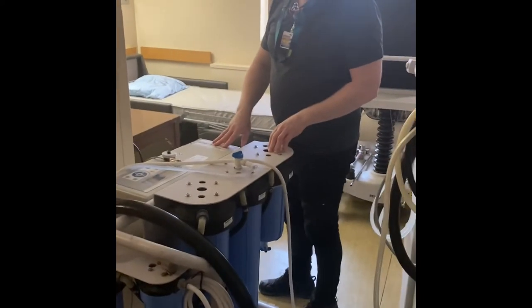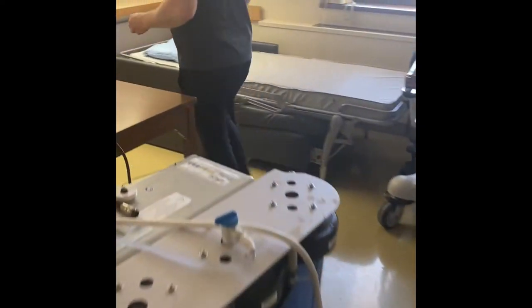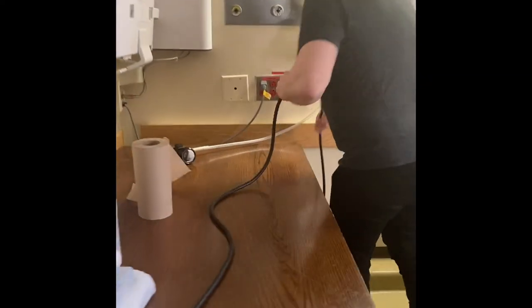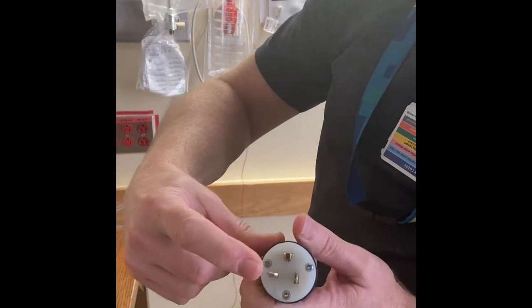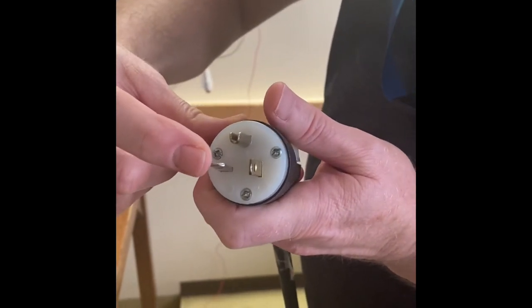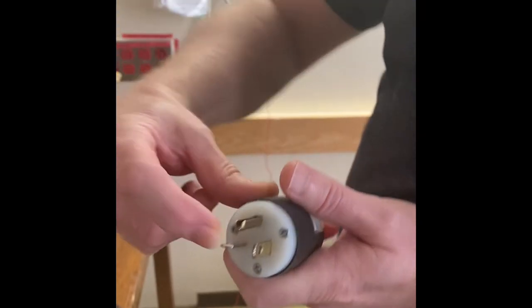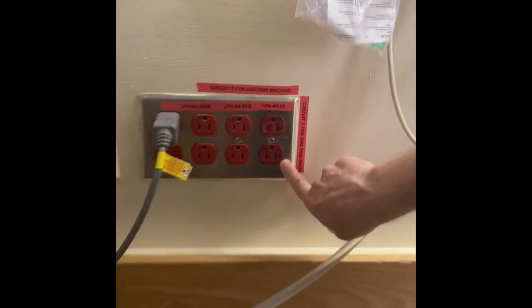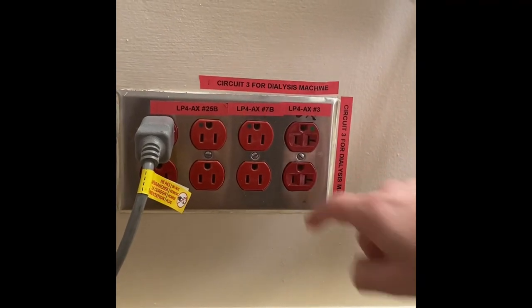Now we can connect the power supply for the Aqua Uno. You'll see it is like an oven or a clothes dryer — you have this specific pin configuration on the connectors, so you have to use a power point with the matching configuration.